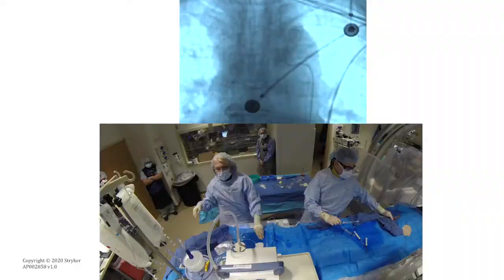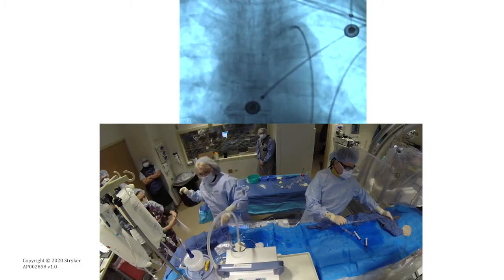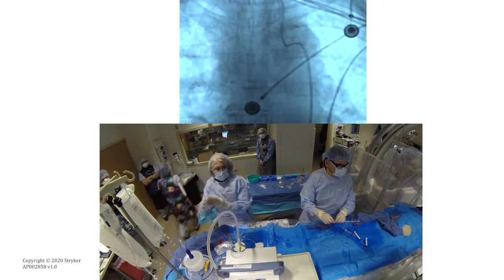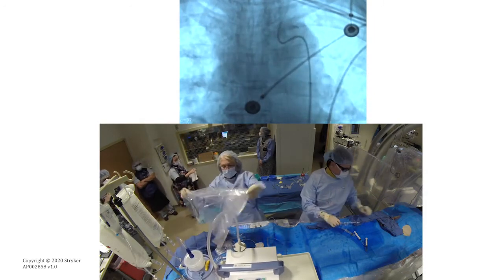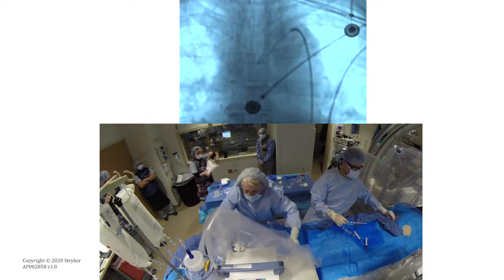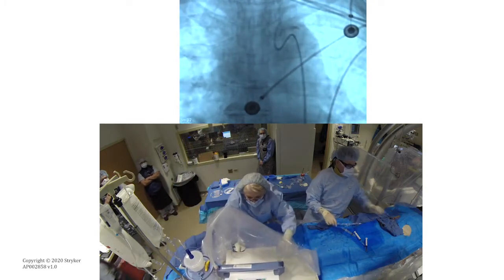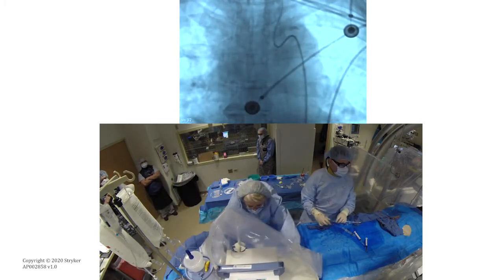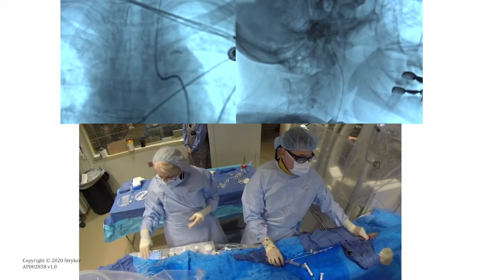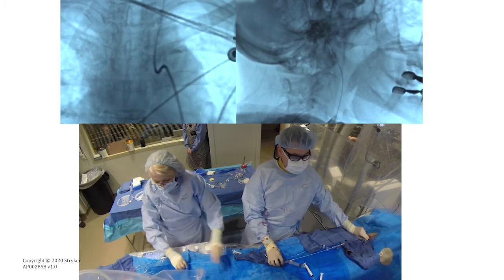After prepping the balloon, we use that over, in this case, a VTK inner catheter. You can see the tortuosity in this particular case, which is why we chose a VTK, but in many cases we can also use the inner catheter that comes in the insert, for sure for the right common and left vertebral. For the left common carotid artery, in general, the VTK seems to work better.